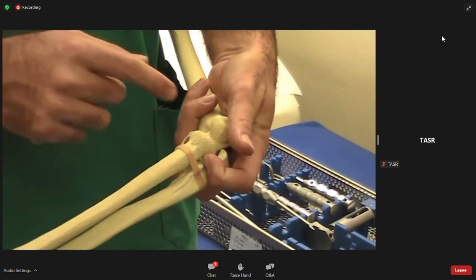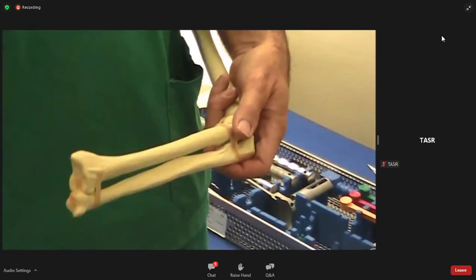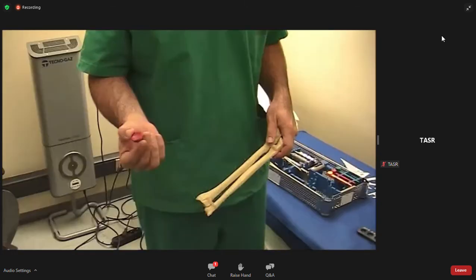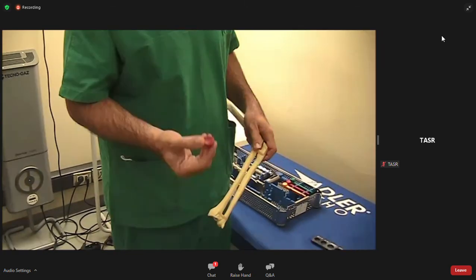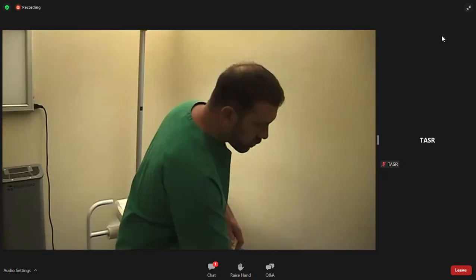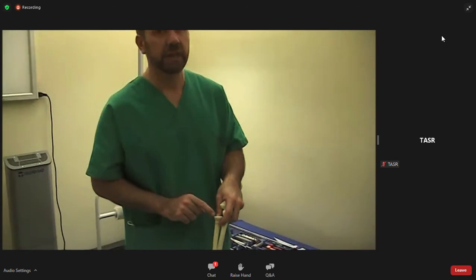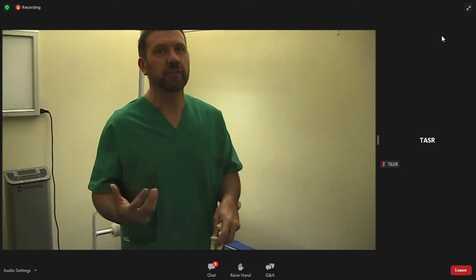So, of course, you're going from an anatomical or a sigmoid radial head to something that is circular. It's a perfect circle. And of course, it's a balancing between the 2 joints that you have to replace. So my suggestion when you are replacing the joint is, by definition, not to take the external diameter of the radial head, in particular the longest one, because by definition you would use a very big prosthesis, or a prosthesis that is bigger than what you would like to use to replace just the lateral column.